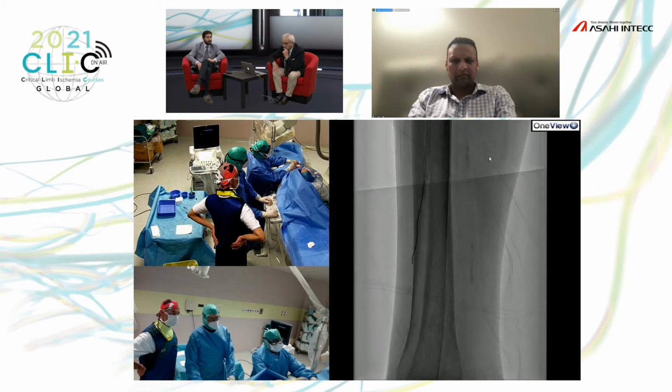So I shifted to the microcatheter from Boston Scientific. I'm sorry, I can't remember the name. It's the one with the three markers.